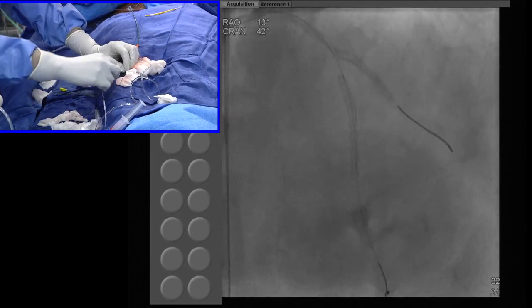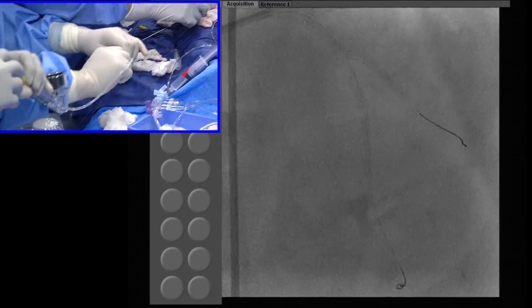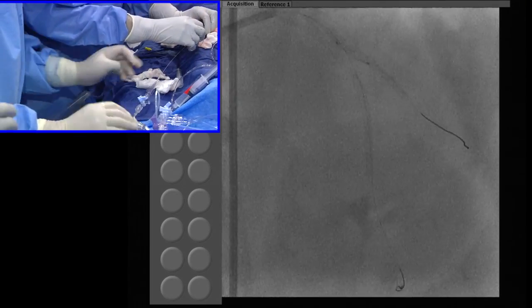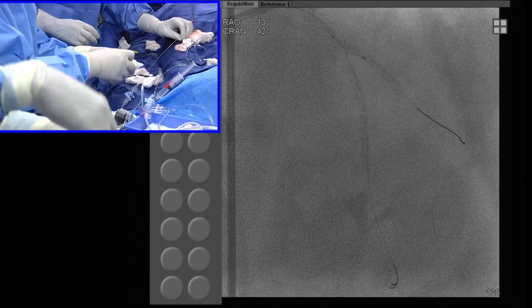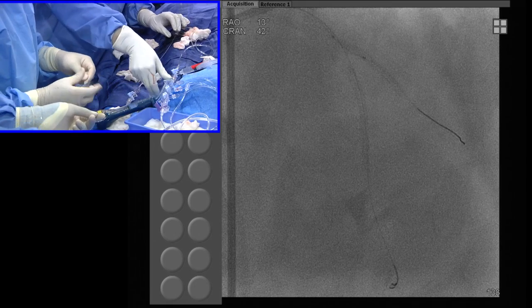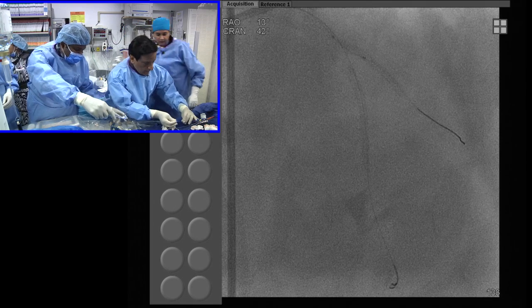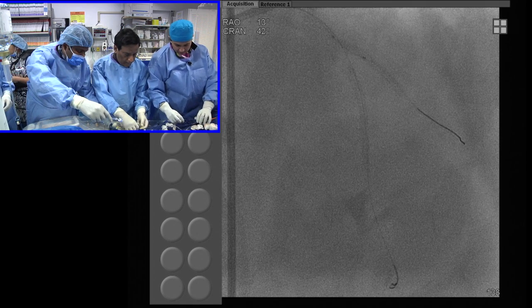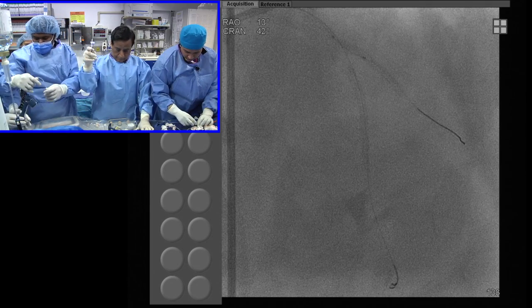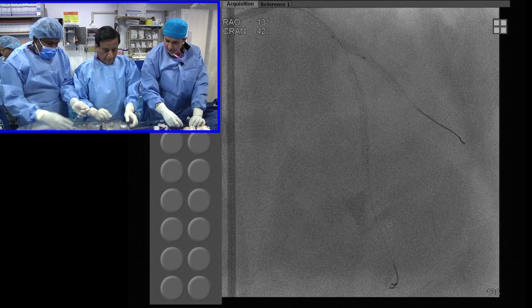So the length of the distal stent ended up being okay. Initially we felt that it was too long, but that should be good. Leave it. Okay. Let's get the main vessel. And we'll still do the final OCT run to make sure everything is in order.